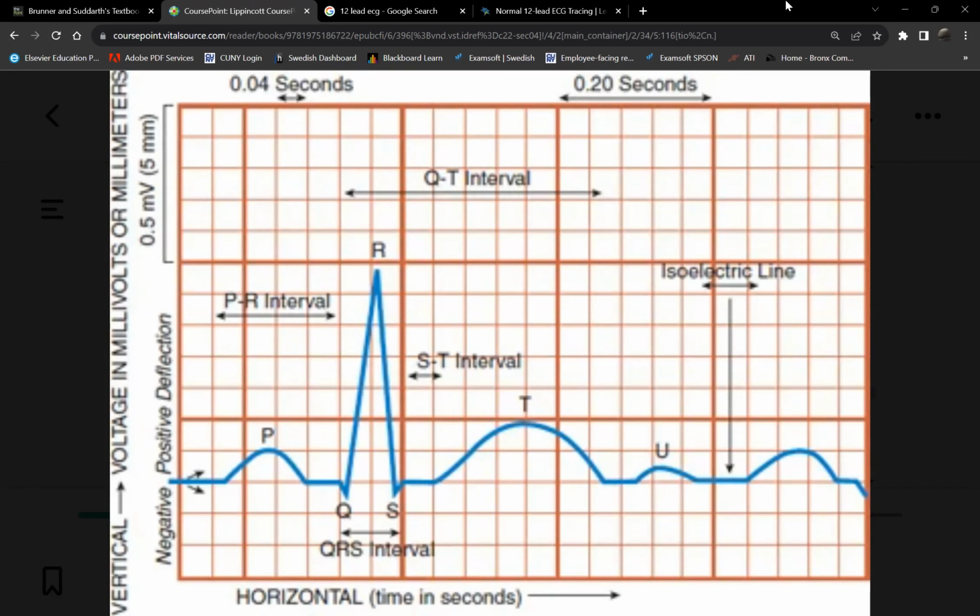And usually, if it's an acute MI, you'll have not only the ST elevation, but since they died, will they repolarize? No. So instead of a positive T wave, this positive means you're repolarizing, right? Since they're dead, they can't repolarize, you have T wave inversion instead.